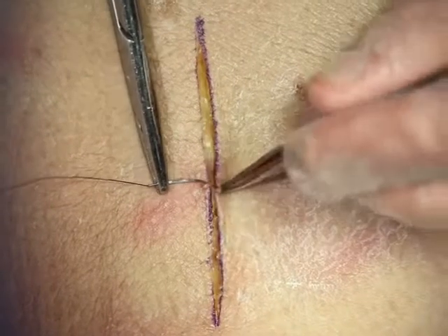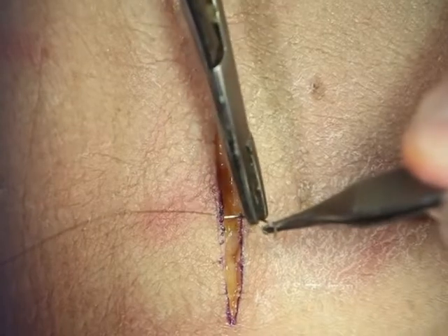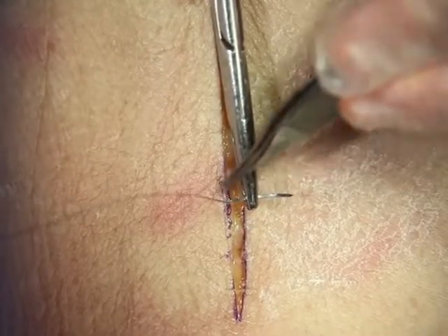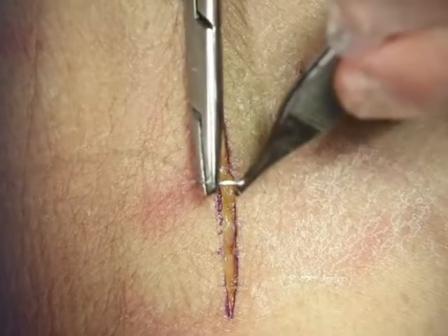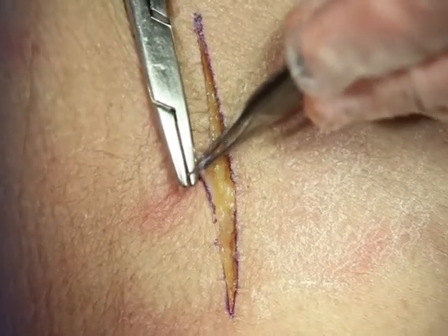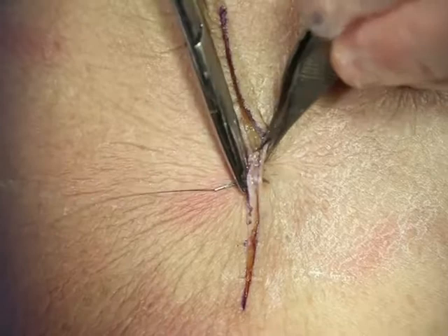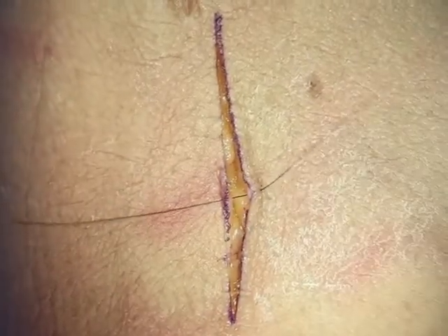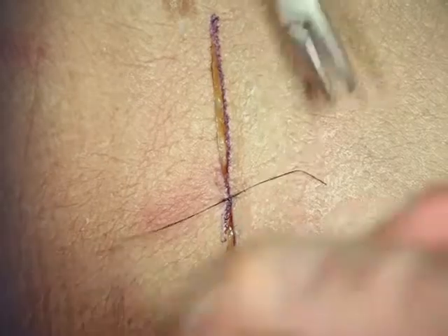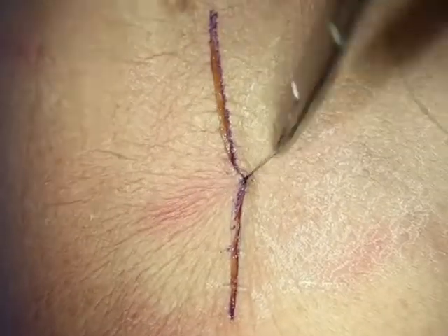The first suture we're going to teach you is the simple interrupted suture. This is the most common suture you'll be using in wound closure. Just a quick tip on handling the needle: you'll notice your needle has a flat portion in the middle — this is where you grab the needle with your needle driver. You don't want to grab it at the end where the suture comes in, the swedge, because it's round and you'll be unstable. Never grab the needle at the tip because you'll dull it. For a simple bite, we'll enter the skin at 90 degrees, going back a few millimeters from the skin edge, and take a nice bite perpendicular to the skin. On the opposite side, the same — exaggerate that 90 degrees so the skin edges will evert and come together nicely. We'll set up an instrument tie; for nylon we do three throws, and clip.